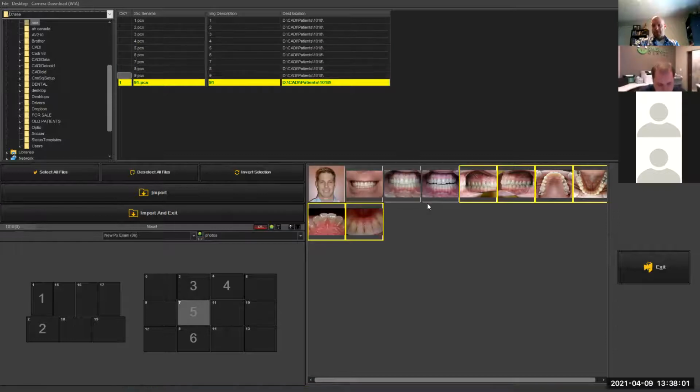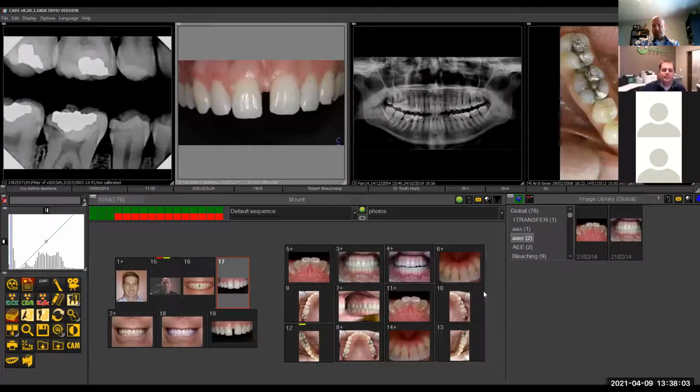So a couple of questions on that. What if we're dealing with raw images? Most of the time you're getting a processed image from the SLR, but if you're doing anything cosmetic for submitting to journals or whatnot, you have to keep a copy of the raw image as well. Does this software handle that, or would it have to be something that I would just have to put in my own file directory system?